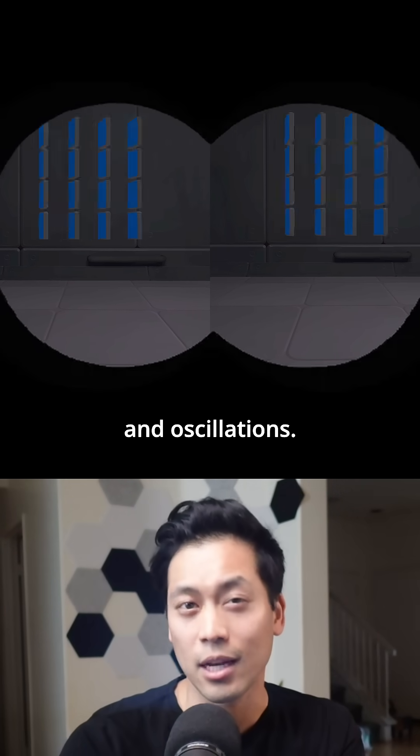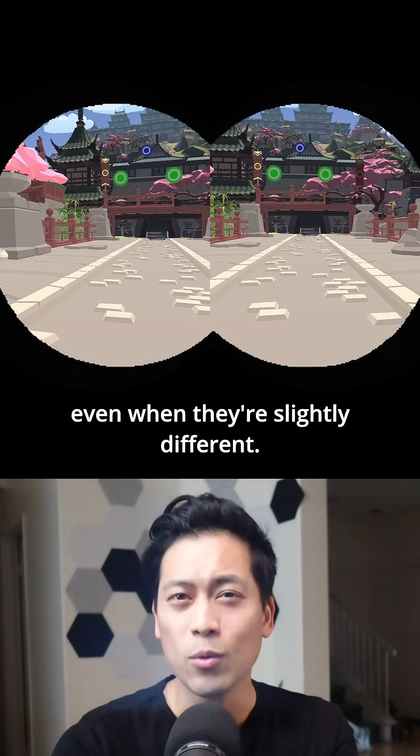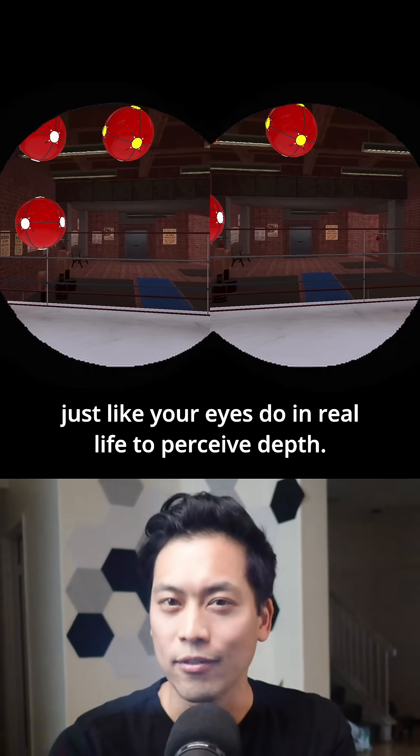Another cool VR feature is using horizontal offsets and oscillations. This helps your eyes fuse images into one, even when they're slightly different. It simulates convergence and divergence, just like your eyes do in real life to perceive depth.